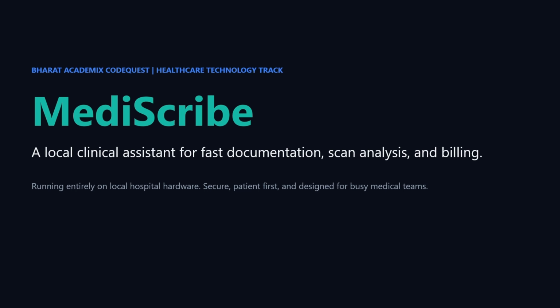So our project is Mediscribe. It's a completely offline, locally running clinical assistant for fast documentation, scan analysis for medical images like MRI or CT scan, and billing for ICD-10 codes.